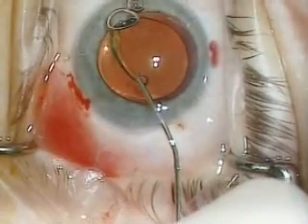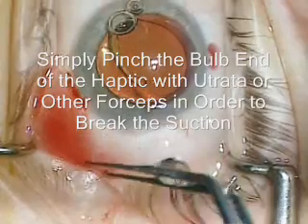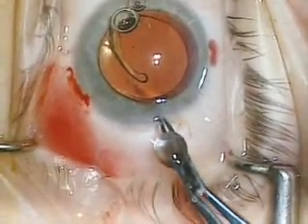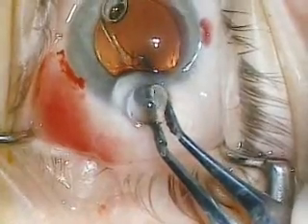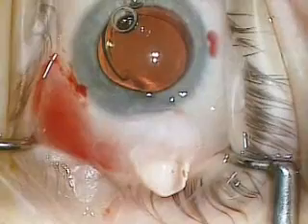and a Utrata or other fine forceps is then used to pinch the bulb end of the haptic in order to break the suction. You can see once this maneuver is accomplished that the haptic falls back into position as it should.